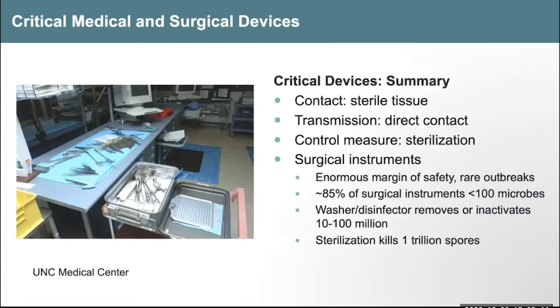All right, so critical devices, they enter sterile tissue. Contact is direct. There, of course, are our surgical instruments. The control measure is sterilization. There is an enormous margin of safety. Very, very rare outbreaks with sterility issues there. In fact, we've studied, by the way, surgical instruments in general. They have less than 100 microbes.